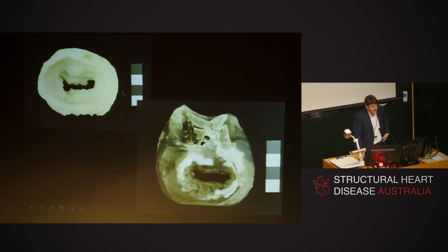And so outside, Nicolette has been doing some studies, doing prints from 3D echo and 3D CT. And here is a CT where we've used a multi-material print. So this is calcification affecting the annulus and also the valve, and the rest of the material of the valve is printed in a clear or flexible material.